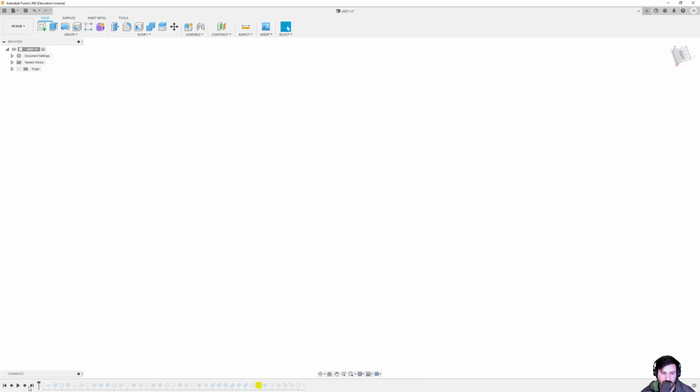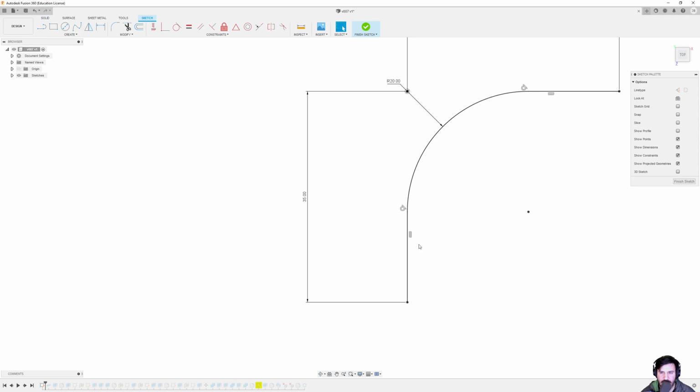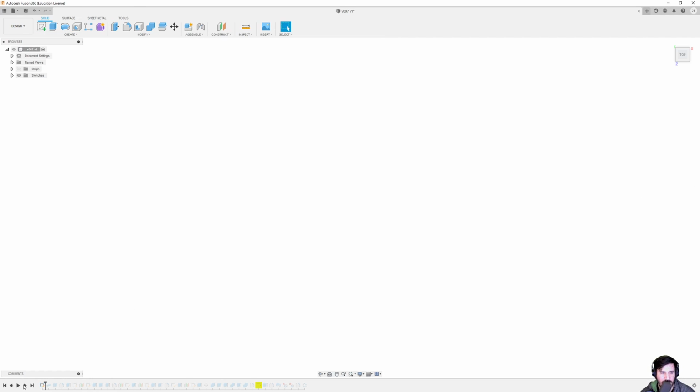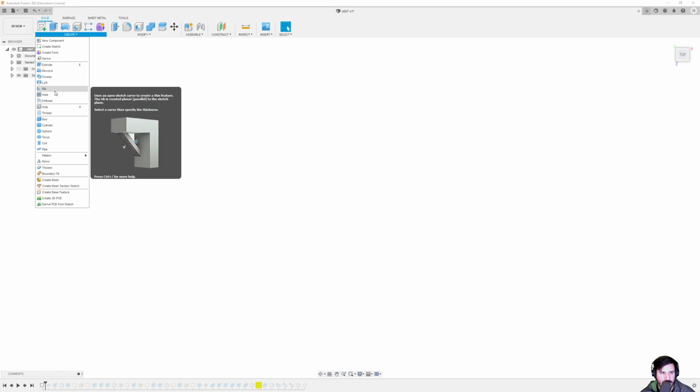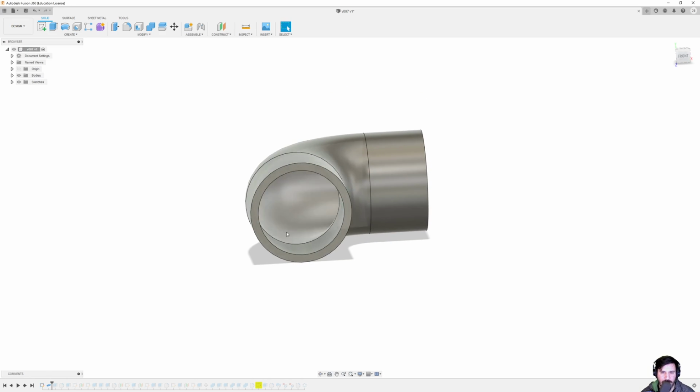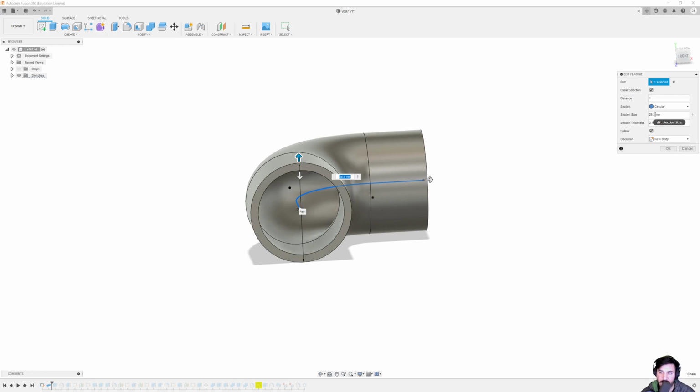So initially what we started out with is a plane, as you do in Fusion 360. If I go and edit that sketch on the plane, you can see I had laid out the length. I did 35 millimeters from this point here, which is also part of this curve, basically just looking for a 90-degree angle. Once that was done, we used the create, I think it was pipe. Yes, pipe. If we do the create pipe, we can specify what kind of diameter we want and how thick we want this pipe to be. 2 millimeters was chosen. I had the original and I measured it and it was about 2 millimeters, so I just stuck with it.